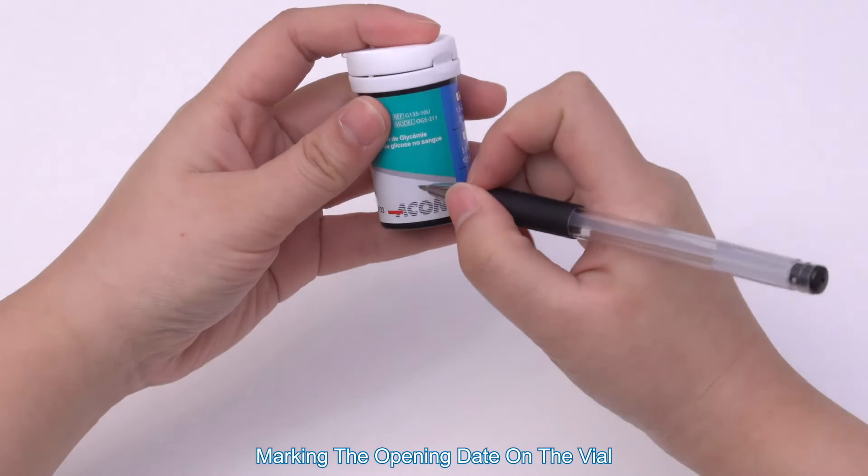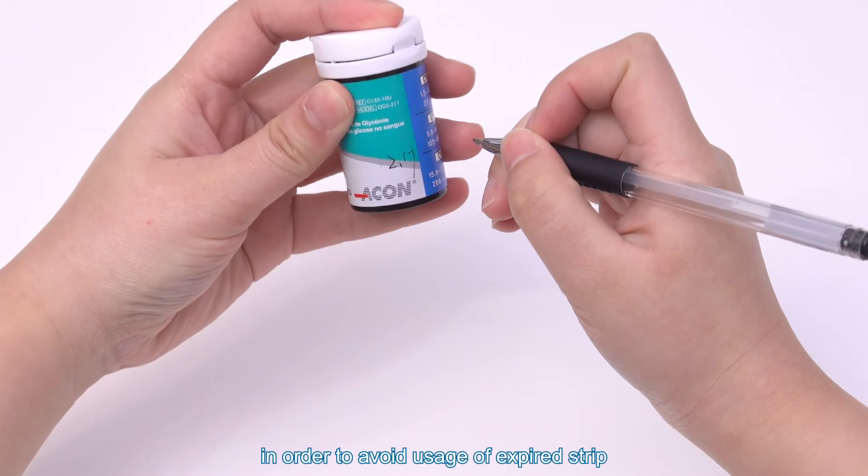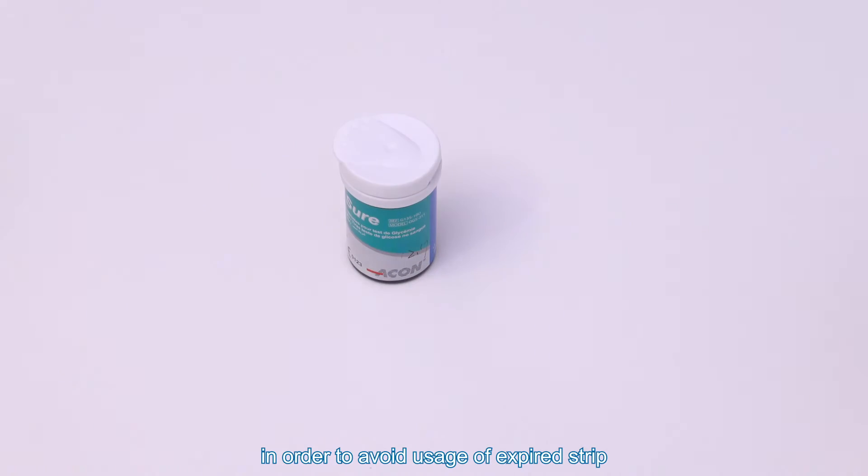Marking the opening date on the vial. Mark the date on the vial during the first opening in order to avoid usage of an expired strip.